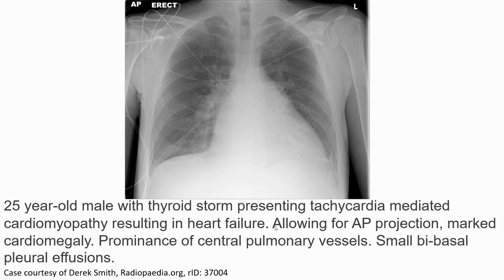The first case is a 25-year-old male with tachycardia-mediated cardiomyopathy resulting in heart failure. The X-rays show marked cardiomegaly, prominent central pulmonary vessels, small bilateral basal pleural effusion. These are the features we can find in chest X-ray that indicate cardiac failure.